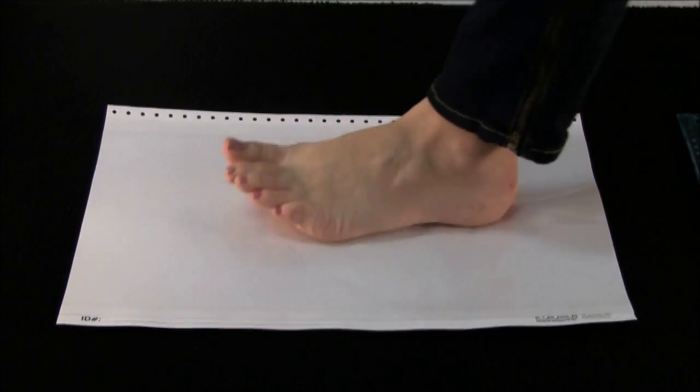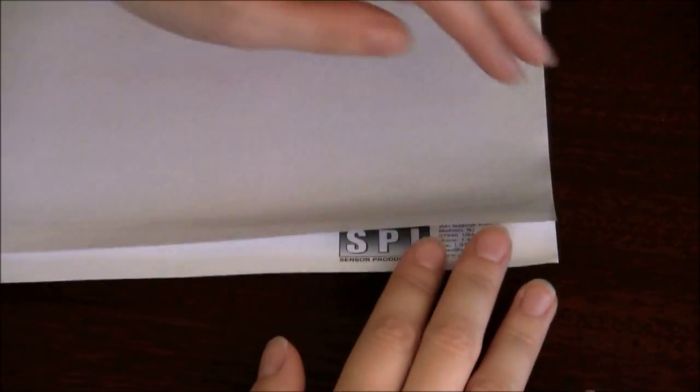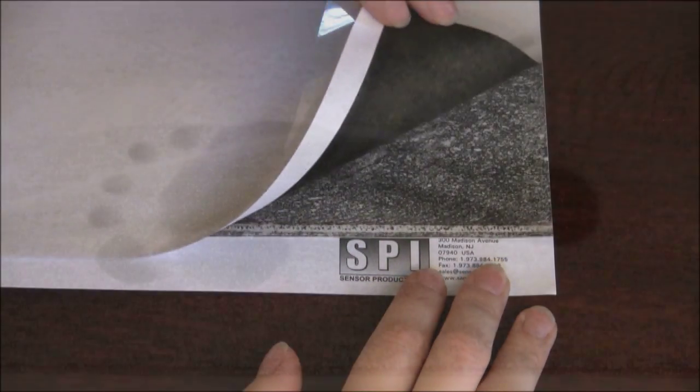In this example, PressureX Micro is used to record a foot impression. After walking across the film, a grayscale pressure distribution profile is captured.